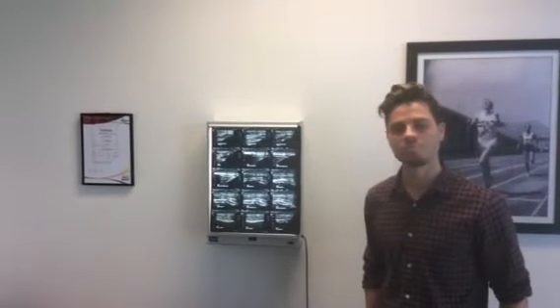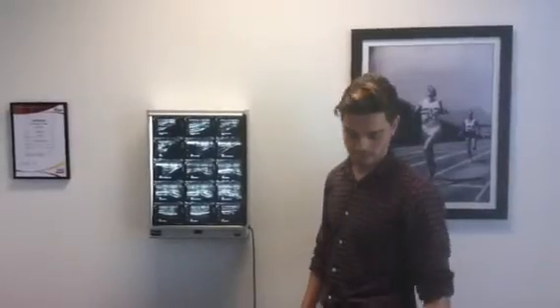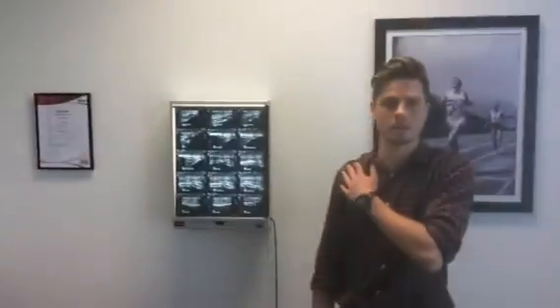It's exciting. So when it comes to tendons, because it's our tendon month, is an ultrasound scan useful? Yeah, they're very useful scans and they've got a few advantages over other scans. They can have a look at tendons, so really important for tendon pathology. So things like repetitive stress injuries like Achilles tendinopathy, where you get the Achilles pain, and also some shoulder stuff, some rotator cuff tendinopathies. They're really useful for identifying structural changes, so looking at how much degeneration or inflammation or breakdown in the tissue may be contributing to that pain.